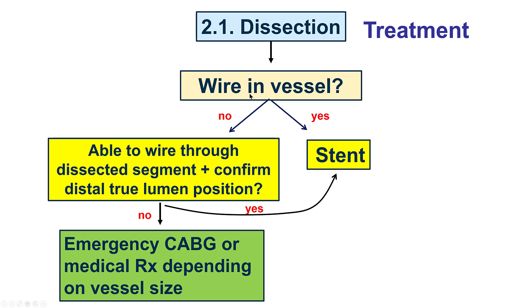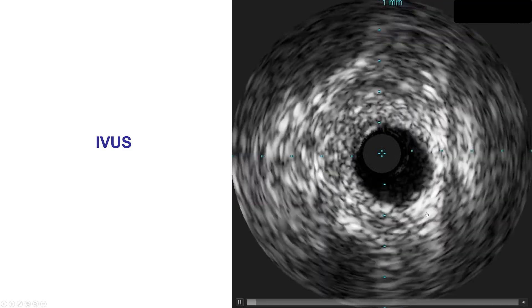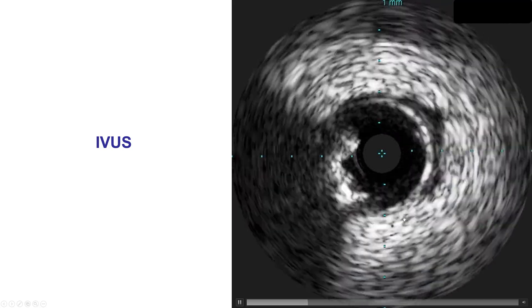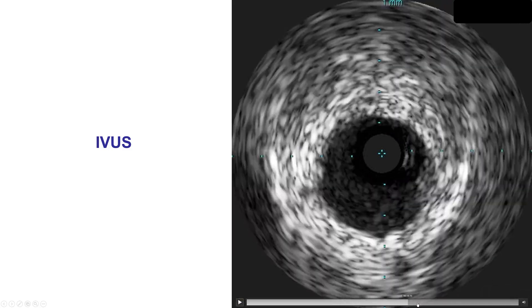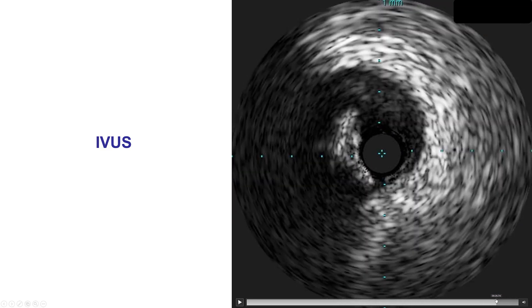The next step depends on whether we have wire in the vessel. In this case, we only had partial wiring. If not, the solution is to advance a wire through the dissection, confirm that the wire goes into the distal true lumen, and then place stents. If it doesn't work, then emergency surgery can be an option. Interestingly enough, after the dissection happened, it was very easy to advance the guide wire distally. But intravascular ultrasound demonstrated that we were in the subintimal position. We can see that the true lumen is compressed at the side of the vessel and the IVUS catheter is in the subintimal position. When we go more proximal, that's where the wire is actually within the true lumen.